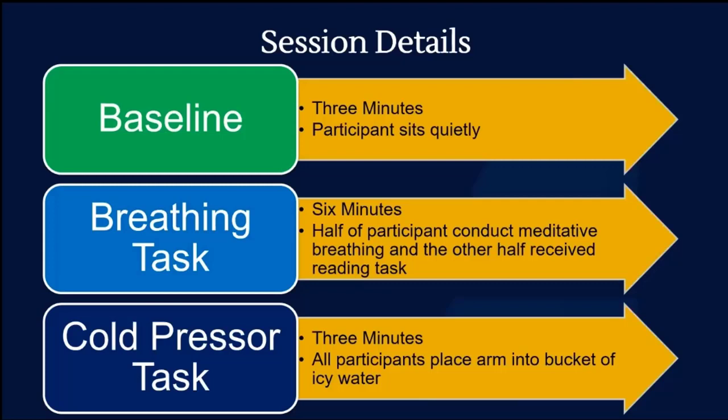And in a lot of studies, we'll see that there are multiple baselines. If it's going to be a longer study, or if you want them to be able to recover, you could simply call that a recovery stage or another baseline. Another really important thing, for those of you that might be doing the Trier experiments, the TSST, a social stress test: a common element of that is that we ask them to stand to give a speech.